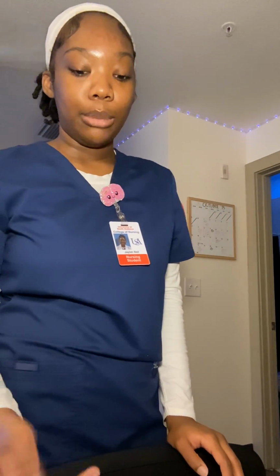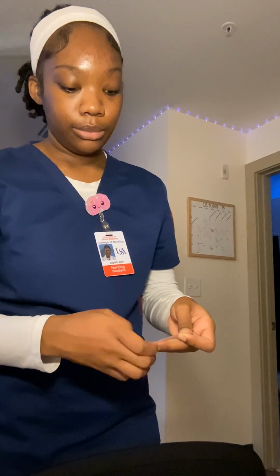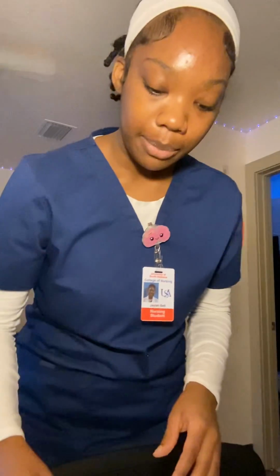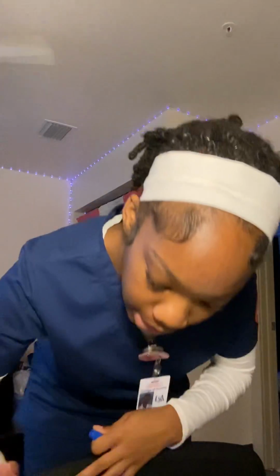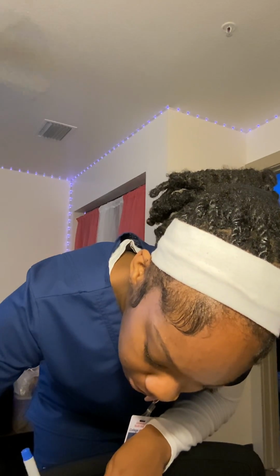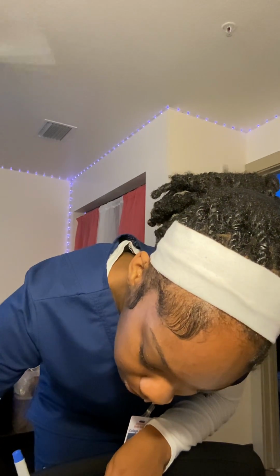Now I'm just going to go ahead and make a label for my syringe before we move into Mr. Jones's room. I'm just going to take a piece of tape here, and on this piece of tape, I'm just going to write my patient's name. So we have Jaguar J. Jones. And I'm going to write the medication, which is Novolin R regular insulin. And then I'm also going to write the dose, which is 10 units.